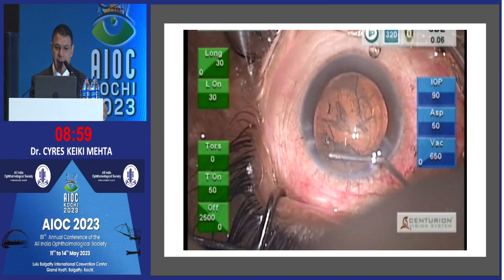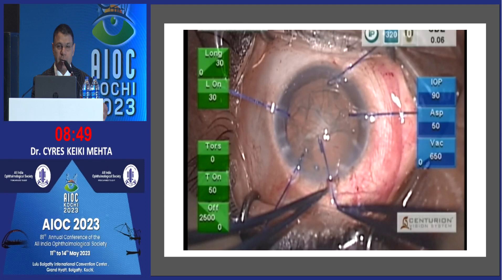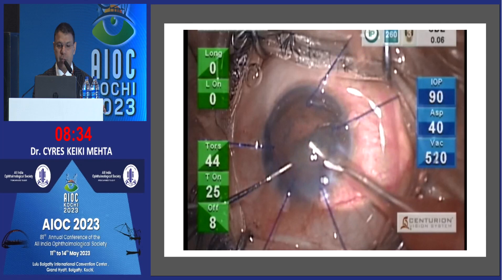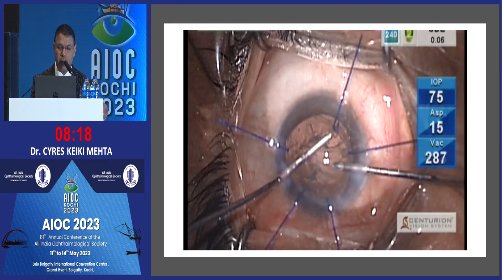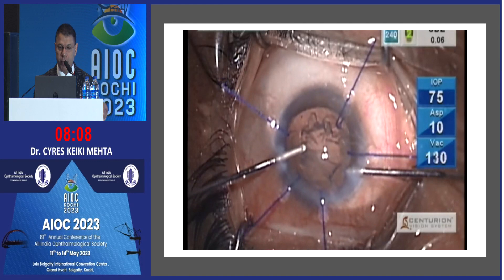So you make a nice smallish rexus, about 5 mm. Then you open your armamentarium of capsule hooks — five hooks are actually used to suspend the capsular bag. If you have a good rexus, which is paramount in this kind of scenario, your capsular bag is now completely stable and transfixed — it is not going to move at all. You can do your phaco maneuvers but you have to go a little slow; you cannot use 700 vacuum otherwise the bag might flop off. Do a gentle irrigation aspiration so you don't dislodge the capsular bag from the hooks.